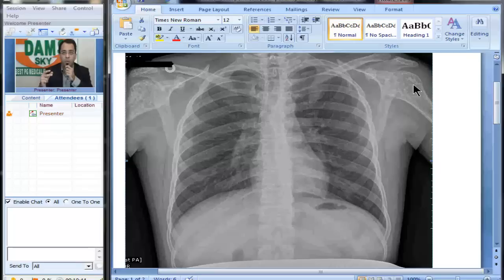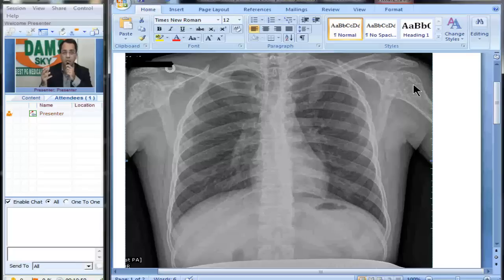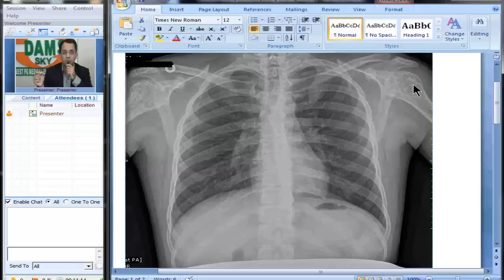Another take-home message from this x-ray: always look at the bony cage. Findings in a chest x-ray may be in the bony cage, not in the lungs at all. So make it a habit to look at the bony cage. Also remember there are other differential diagnoses of sclerotic lesions which include sclerotic metastasis, mastocytosis, and tuberous sclerosis. However, this is a typical case of osteopoikilosis, also called the spotted bone disease. Thank you.